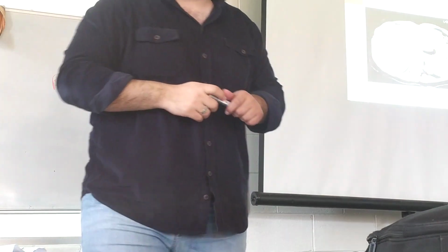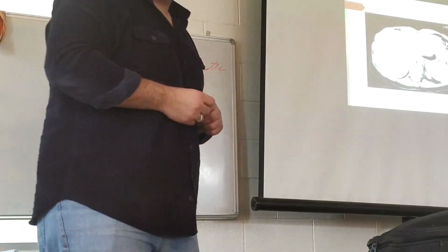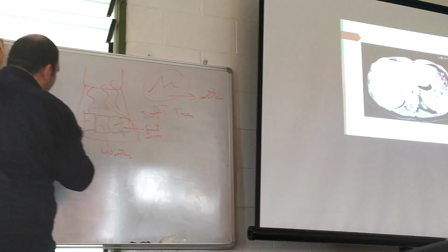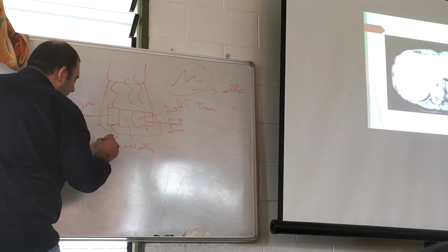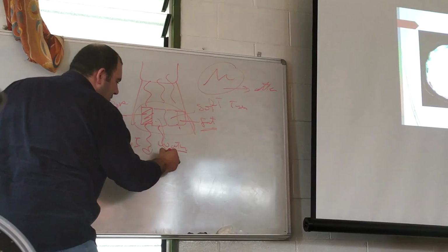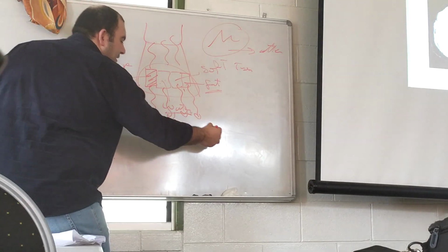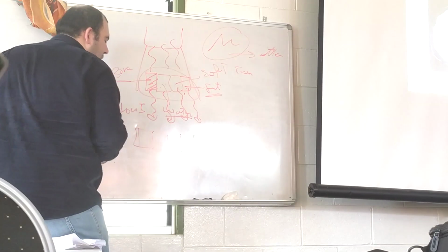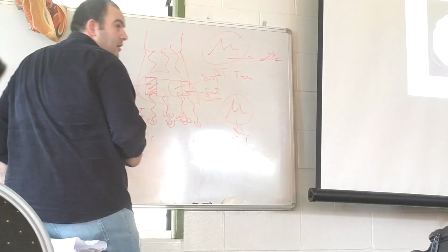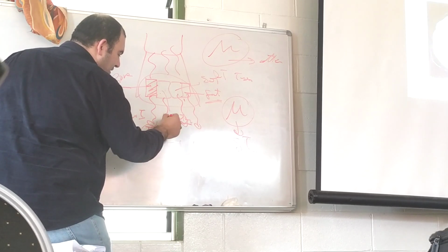Which one has higher attenuation coefficient, bone or air? Bone, because bone has higher density, so it has higher attenuation coefficient. The radiation coming out from bone will be low intensity because bone absorbs a lot of radiation, but water will be less, and soft tissue as well. According to the density of different materials, you will find different signal intensity. Detectors will be behind the patient. So you have different attenuation, which causes different signal intensity, and using this attenuation value you have different transmitted intensity.